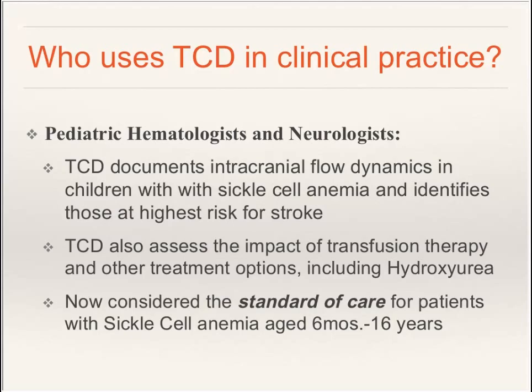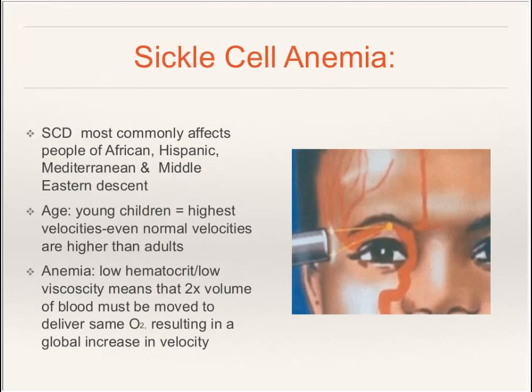Now, you will learn as you move those children from the age of about 13 to 16, they begin to grow. They become a little more difficult to evaluate because the bone area that we're insonating through begins to ossify, and it makes it a little more challenging, much like performing a TCD in an adult.